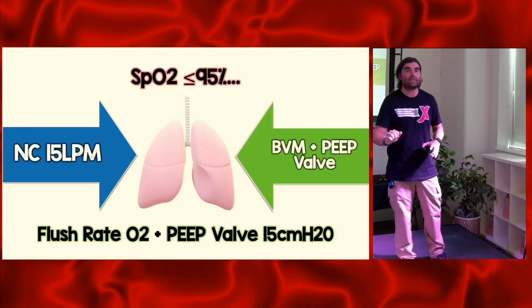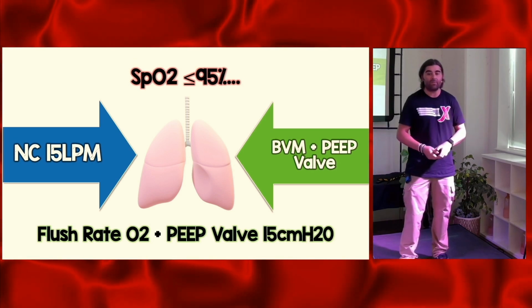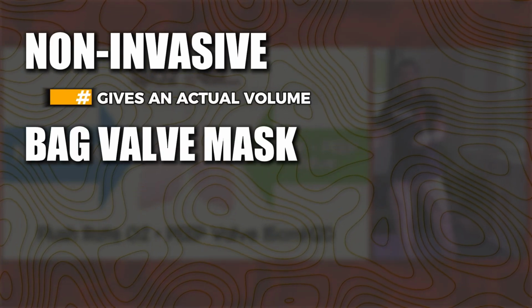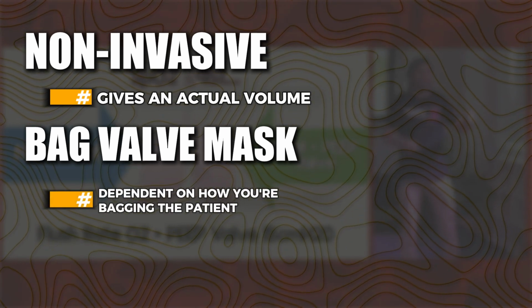So this is my next option, which I think is probably pretty close to equivalent, except it's a little more clunky. Non-invasive is going to give you an actual volume. You know what the patient's getting. With a bag valve mask, it's totally dependent on how you're bagging the patient in terms of what they're getting.